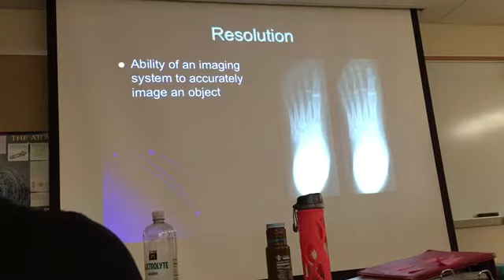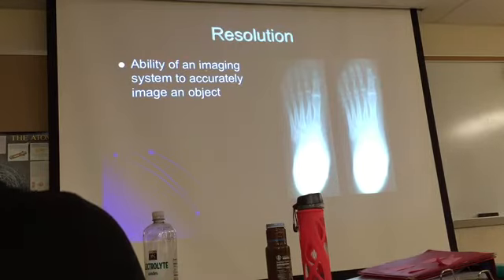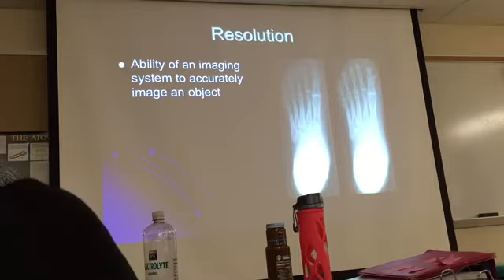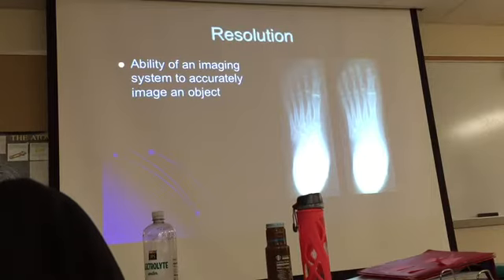So resolution is the ability of an imaging system. When you hear this term, imaging system, that refers to the combination of the screen and film. So ability of an imaging system to accurately image an object.